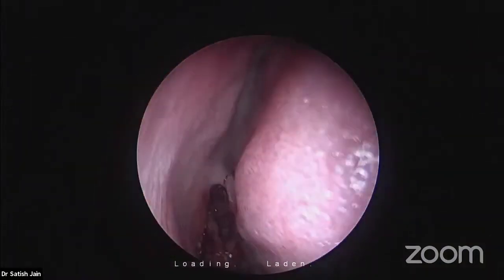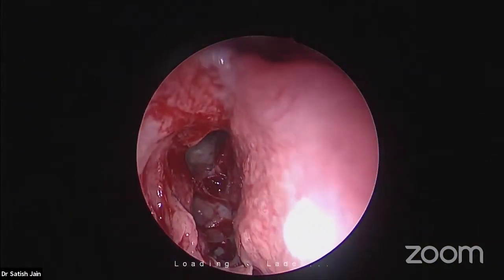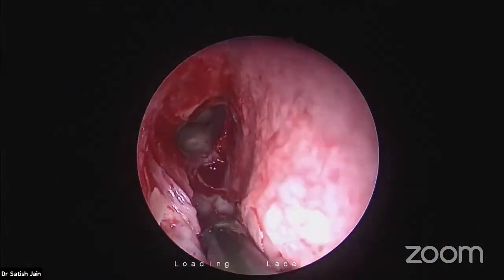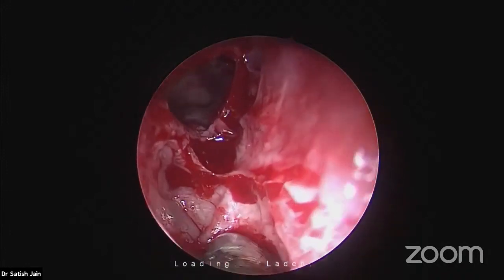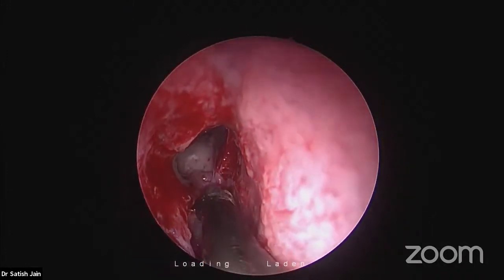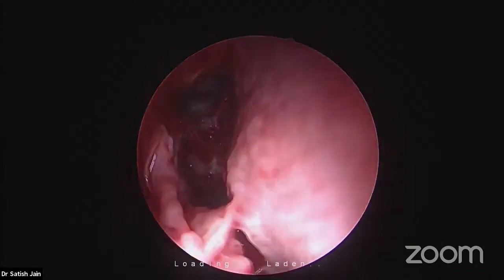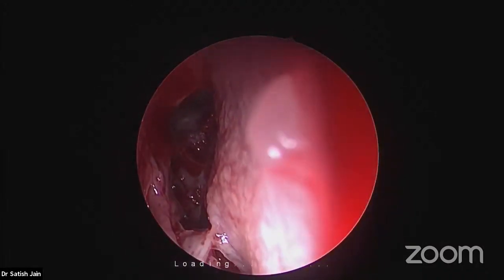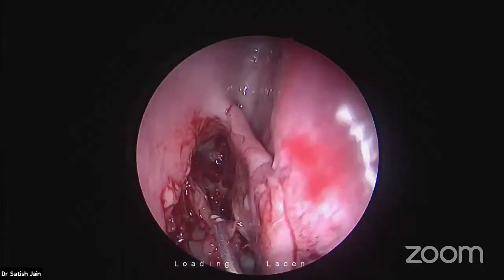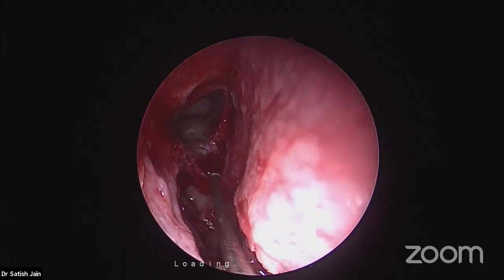There are many names to that. Now see the artery better or not? This is the artery, running obliquely. And what is this small recess above? This is the suprabullar recess. See this, this bulla, which was coming over here, was going to the skull base, where this was the attachment of the bulla.